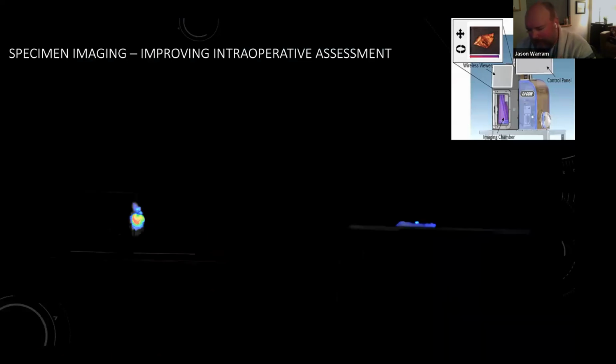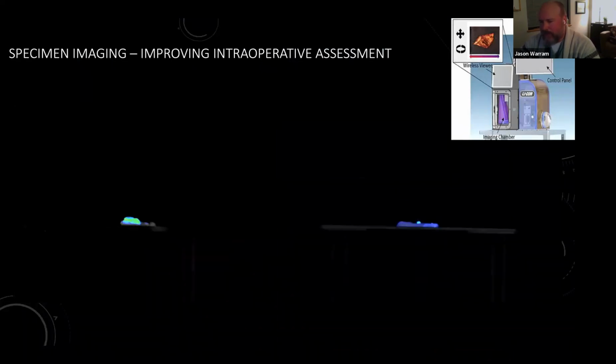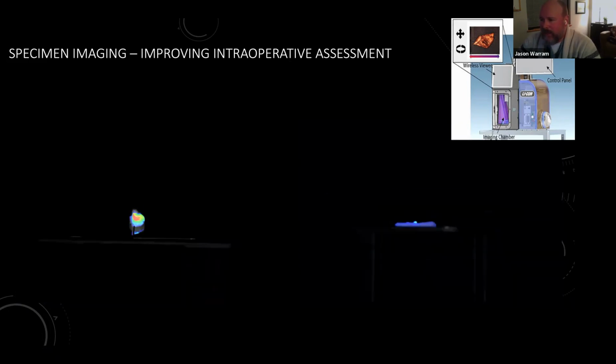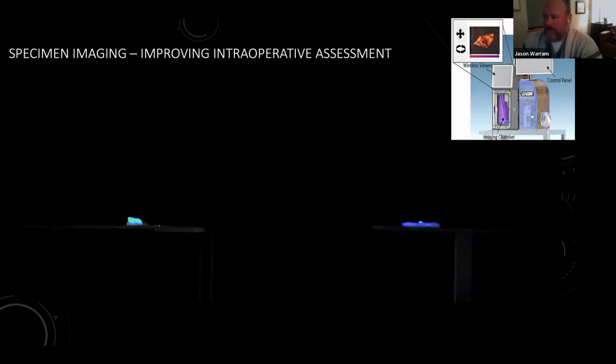The other trend that I'm seeing happening over the last 5 years has been the movement of the fluorescence-guided surgery into pathology. A lot of these agents that are being used survive formalin fixation. In addition to prior to formalin fixation during intraoperative assessment, the innate characteristics of these tumor tissues to have the fluorescence probe bound to these cancer cells can be used by the pathologist to localize disease for intraoperative assessment.